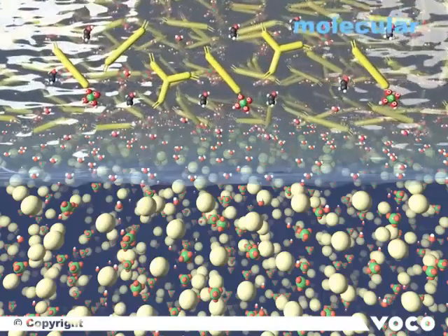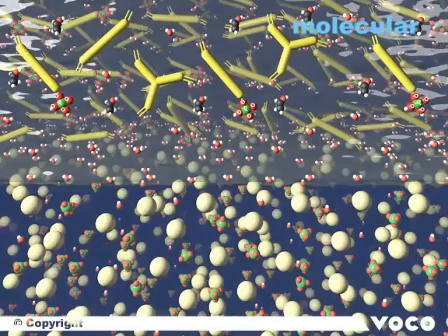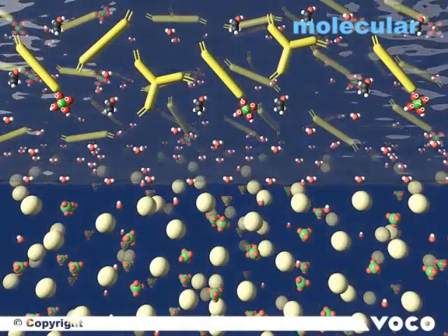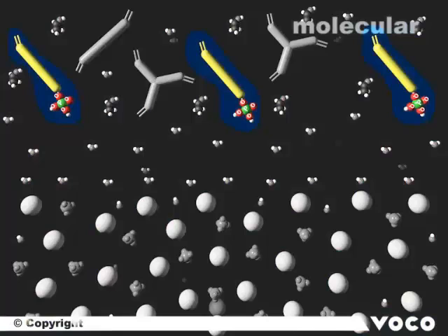The adhesive is applied. For reasons of better clarity, only the first level is shown in the next step. Here all components from the adhesive liquid are depicted. Once again for repetition: the acidic adhesive monomers, the cross-linking monomers, and the solvents ethanol and water.